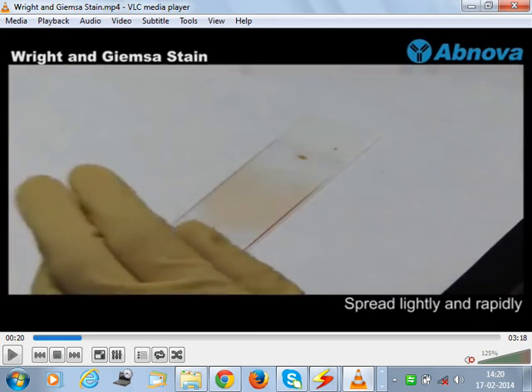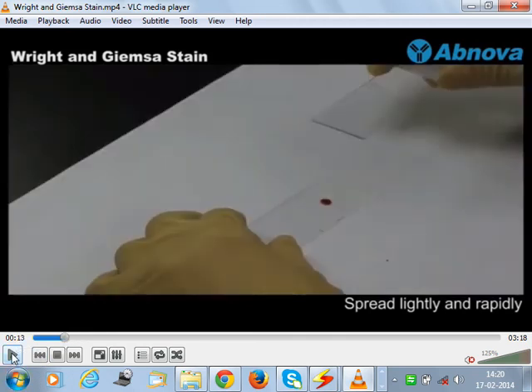Because only after you do it and finally stain, you will know whether your smear was good or bad, whether the cells could be countable or not. You won't know now; you will know only at the end. Understood? Okay. Shall we proceed? Do you want to see this once again? Yes. We'll see this once again.